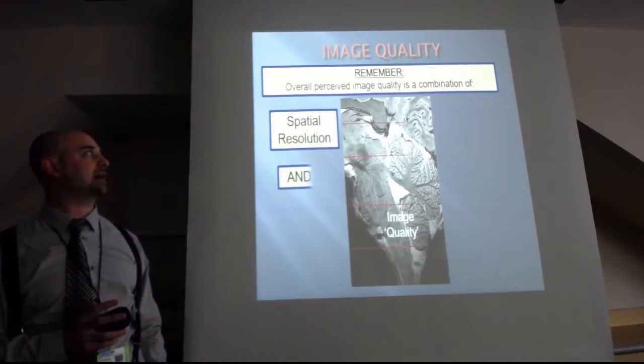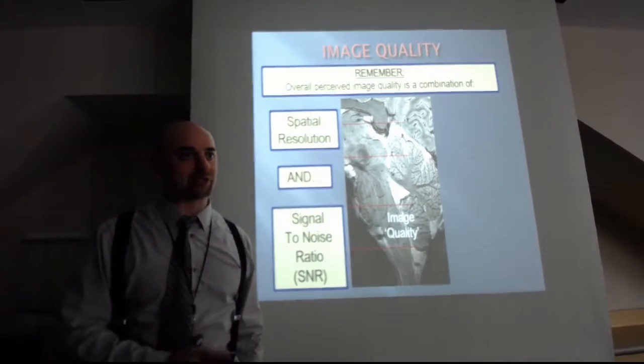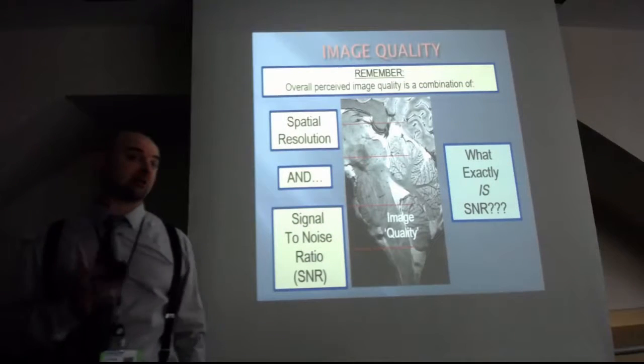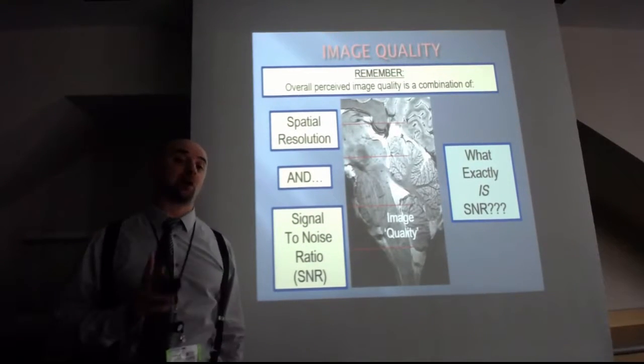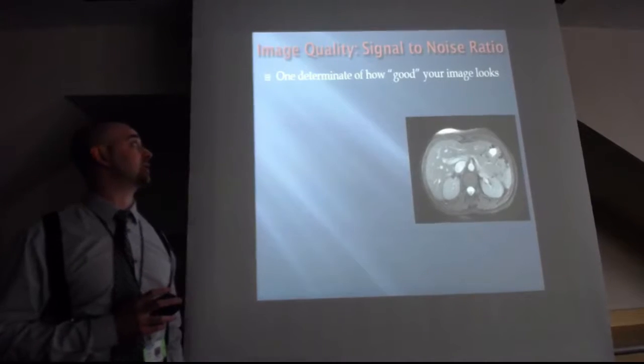Okay. Now, remembering that perceived image quality is a combination of both spatial resolution and signal-to-noise ratio, let's talk about what the signal-to-noise ratio is.